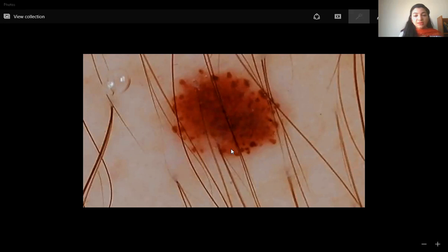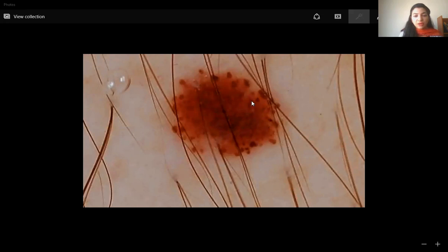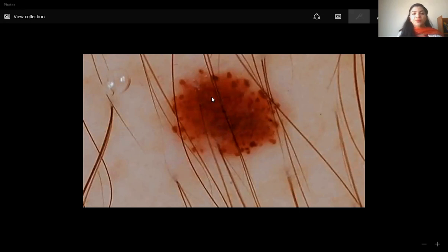Coming to the last lesion: this one is a pretty symmetrical lesion. On the periphery are brown clods, while in the center is a structureless brown area with some scattered dots and clods. However, the lesion is perfectly symmetrical with no blue, gray, or abnormal network. This one is a common melanocytic nevus.